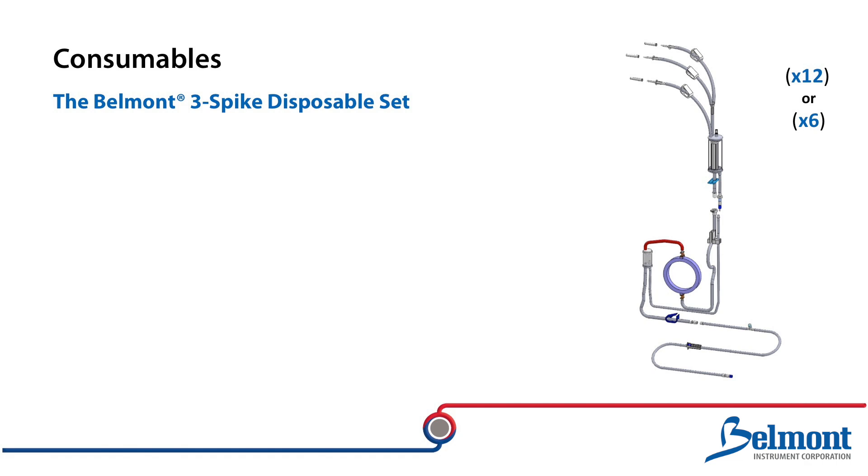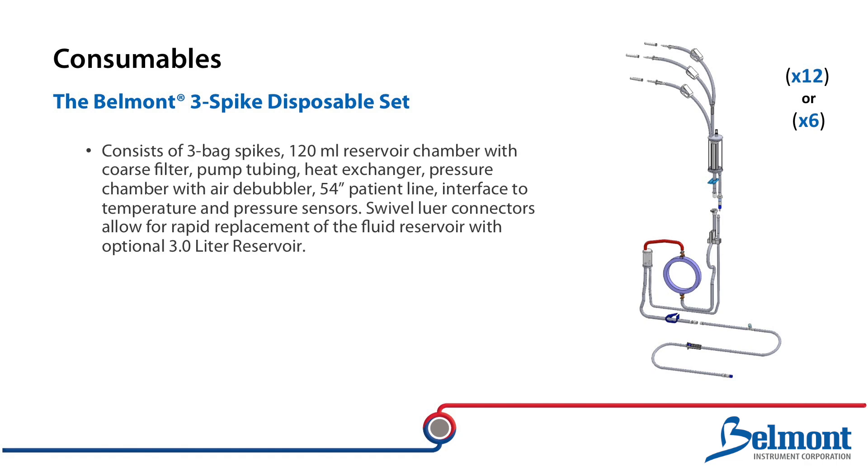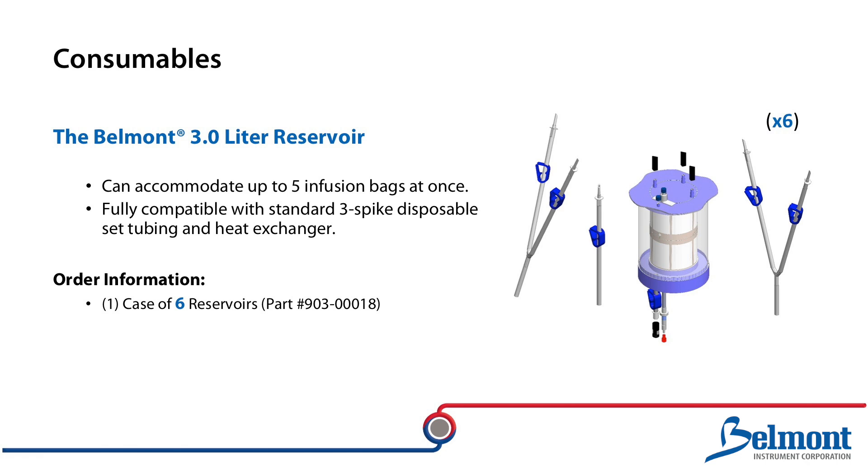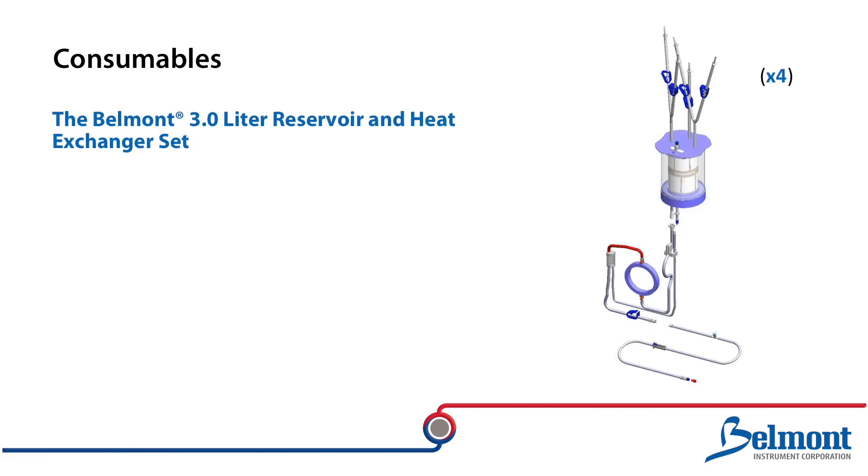The Belmont 3-spike disposable set contains everything you need for a procedure and is the only consumable required to operate the rapid infuser at its full range of flow rates. The disposable set consists of three bag spikes, a heat exchanger, a 54-inch patient line, and a 120-milliliter coarse blood filter reservoir. Quick connections below the reservoir allow for easy and rapid replacement with the optional 3-liter reservoir. The 3-spike disposable can now be ordered in quantities of either 12 or 6 disposables per case. The 3-liter reservoir can accommodate five fluid bags at one time and is fully compatible with the standard 3-spike disposable set tubing and heat exchanger. The reservoir can be easily installed before or during a procedure in replacement of the standard 120-milliliter reservoir. The Belmont 3-liter disposable set offers the convenience of ordering the 3-liter reservoir, heat exchanger set, and patient line in one simple kit.